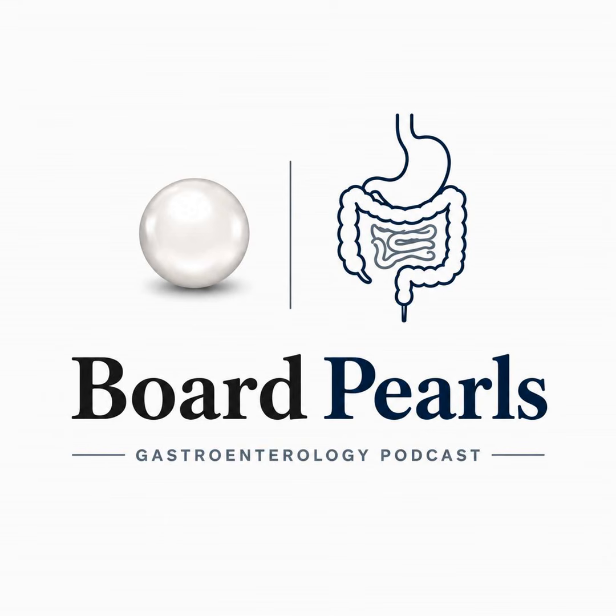FAP changes the surveillance picture, and it leans on one tool that is easy to get wrong on a test stem. To see the ampulla en face, you need a side-viewing duodenoscope. A standard forward viewing scope looks straight ahead and slides right past the papilla on the sidewall. FAP duodenal surveillance, and biliary inspection in particular, uses the side viewing scope. It runs every 6 to 12 months in patients with established duodenal polyposis or a prior ampullary lesion.